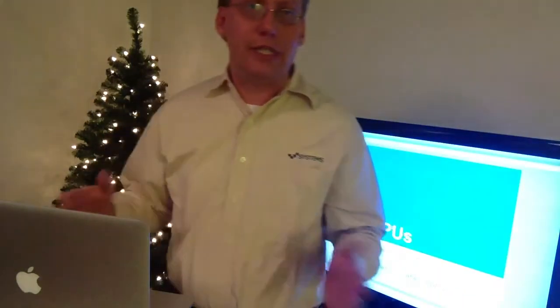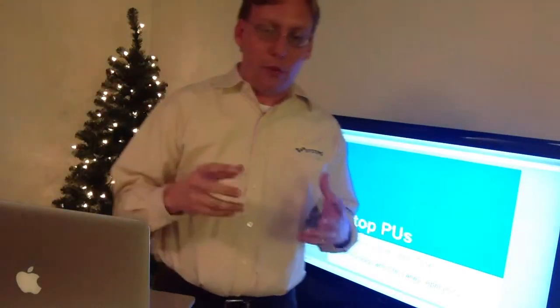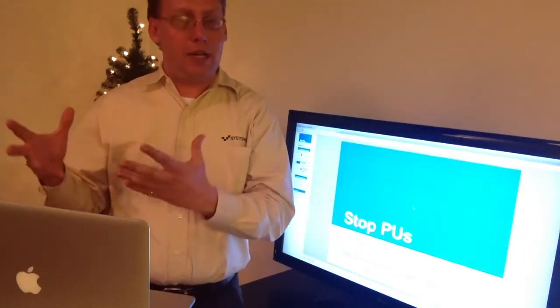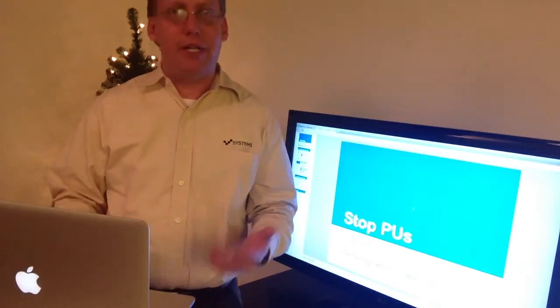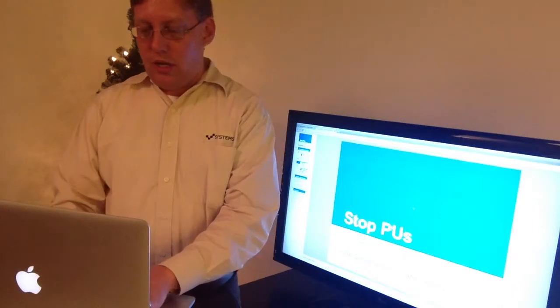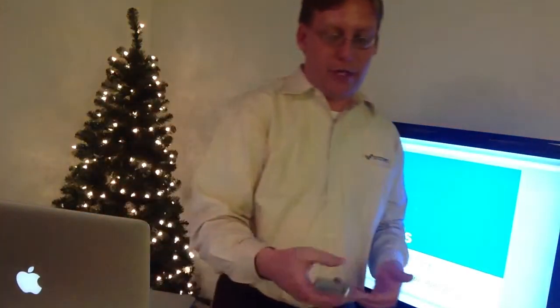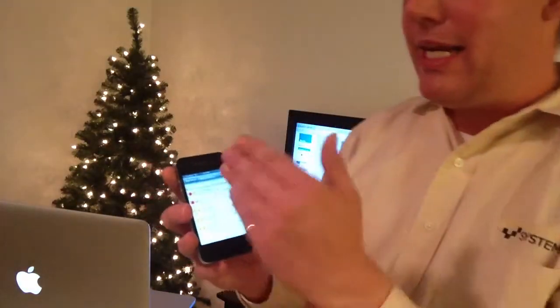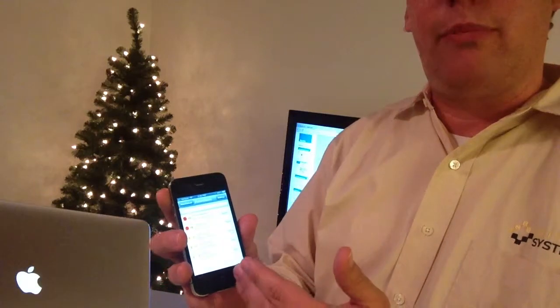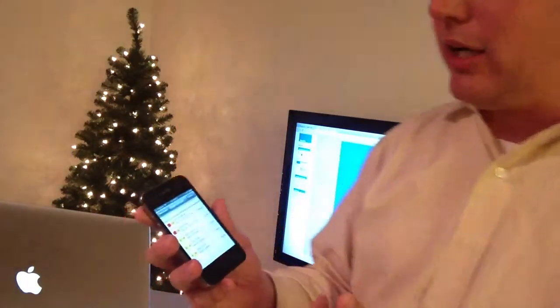So now here's the really good part. In skilled nursing facilities and ICUs, we see this as a really breakthrough market for this type of capturing of data. But the best part of it is the EHR and PHR integration. So when you capture all this information, you do it as a nurse at the beginning of your shift. You get a list of the patients that come into the system from the EHR or the custom web application, which is on Azure in our case.